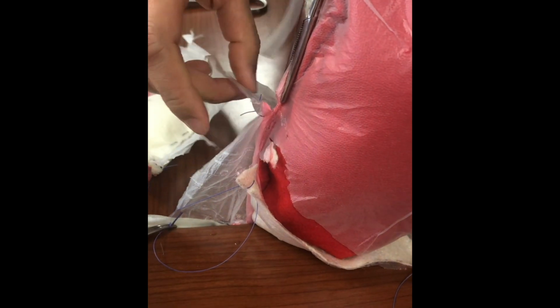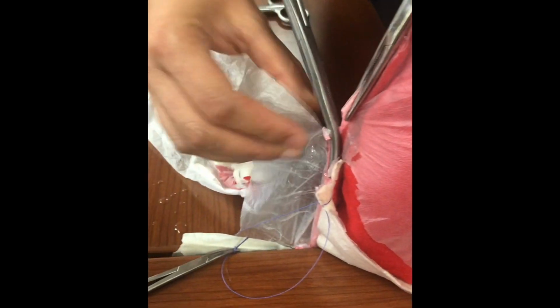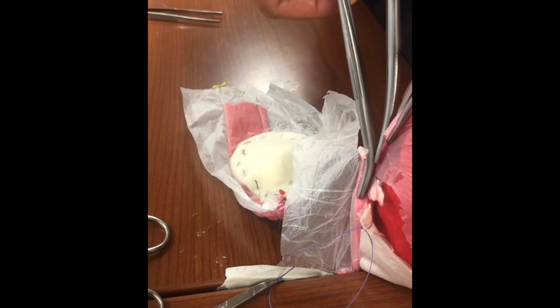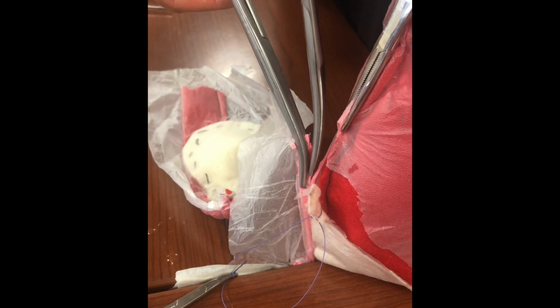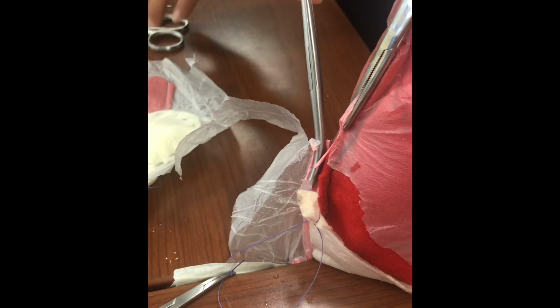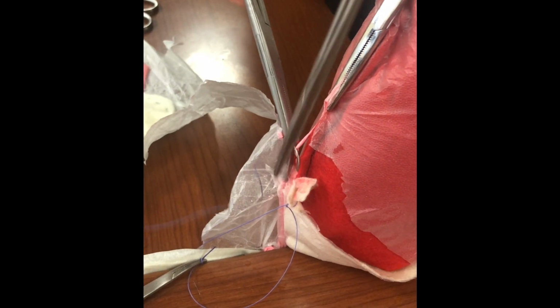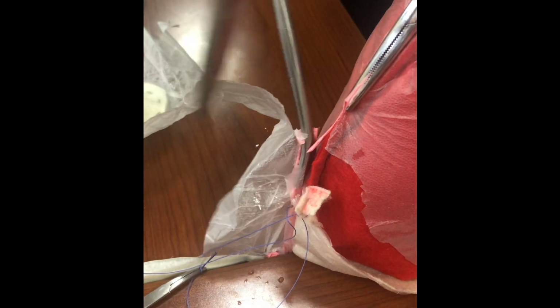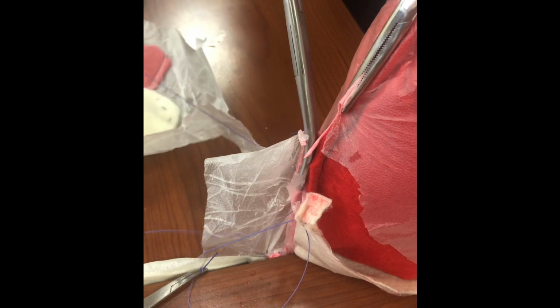Using a curved Heaney clamp, clamp the uterine artery downwards, like so. Then dissect down the uterine artery. To suture ligate, take a suture and place your needle right at the Heaney clamp, entering medially from anterior to posterior, like so.